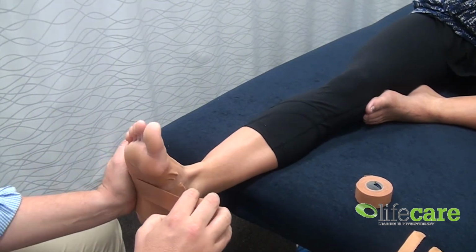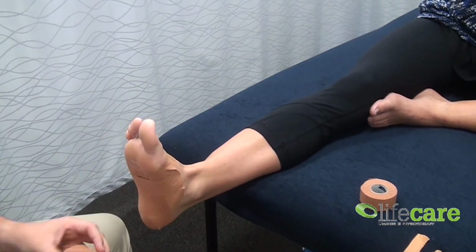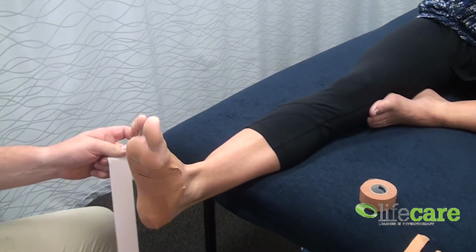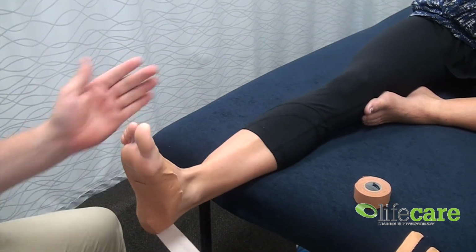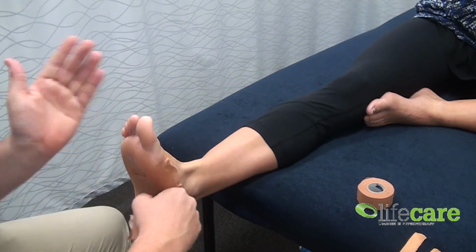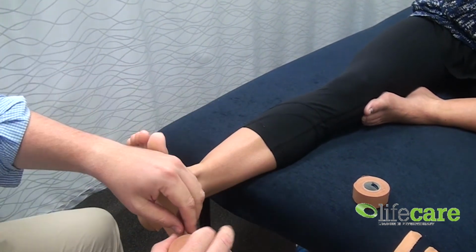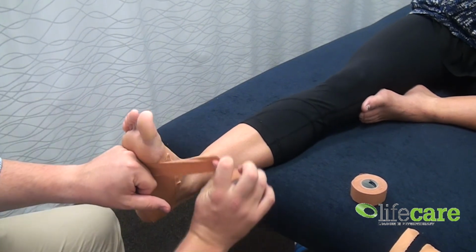Laying down everything nicely and making sure you get a good even coverage. From here, we're just going to lock everything off. So taking the edges, starting from the outside, coming around, keeping all the rough edges locked up, and finishing again by just splaying the metatarsal heads and pushing them wide.